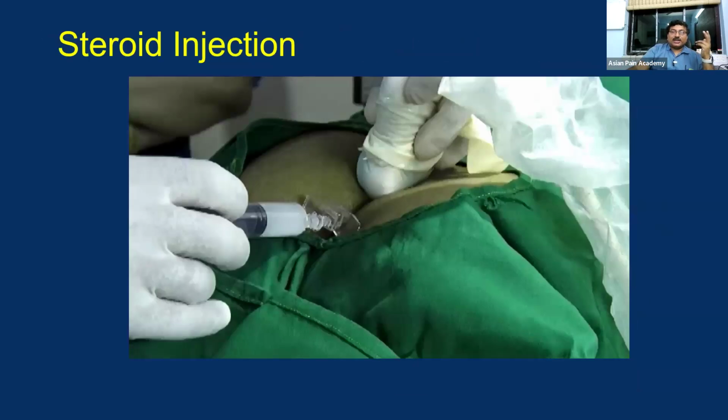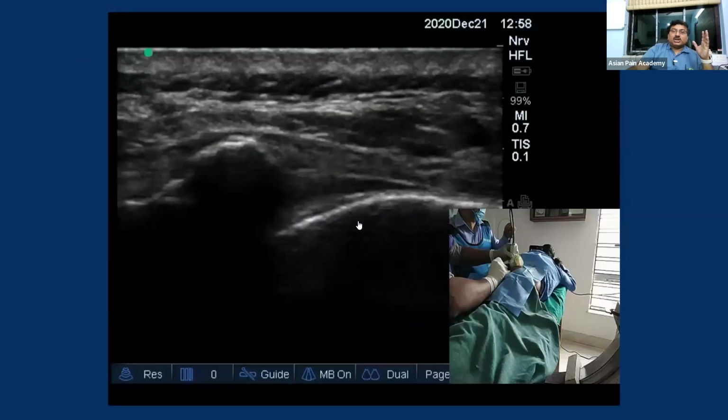In case you have the hybrid technique, you can go for it and ultimately you can inject under vision. So this is how you should complete it. Now regarding which one is better, fluoroscopy or ultrasound? I usually tell that the best is the hybrid technique because here we are getting the advantage of ultrasound: under ultrasound guidance, as we are not drifting from the central plane, it is comparatively easy to put the needle in.